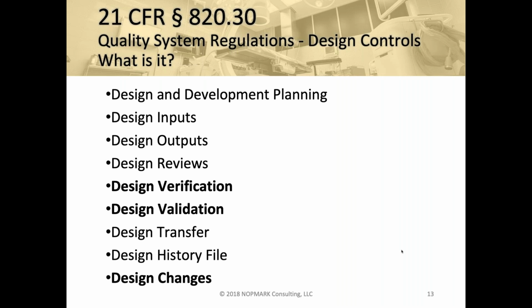In addition to those basic aspects, which is your basic planning, your basic requirements, the regulations do call out reviews. And these reviews are not just reviews around requirements. These are reviews around your test cases and your test plans and all of the normal test artifacts a tester would create. Within these design controls are the big items, verification and validation. And these are not very different than the definition of verification and validation you would see in other industries or even in the ASTQB syllabus.